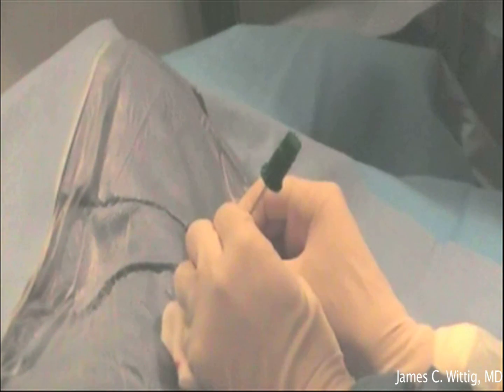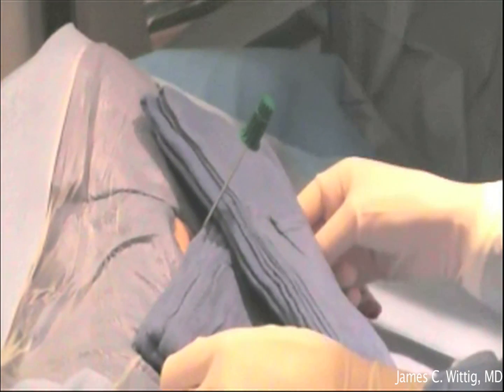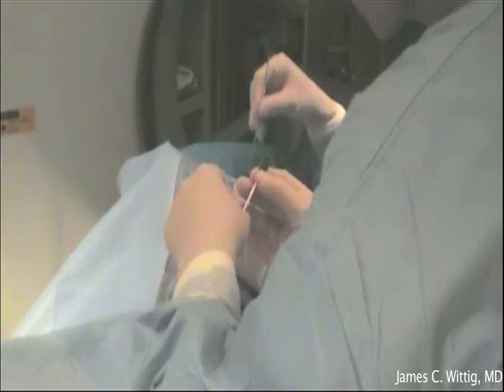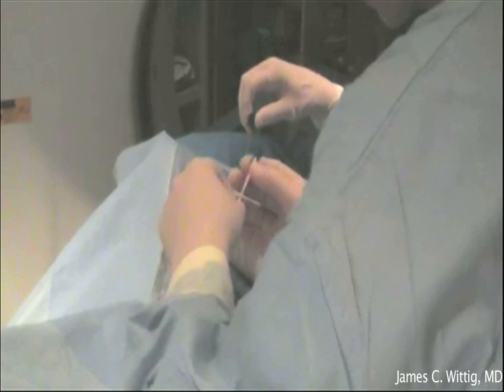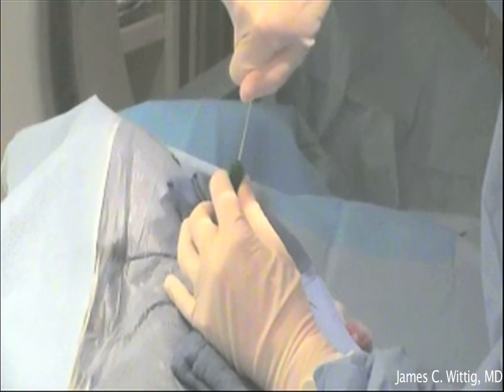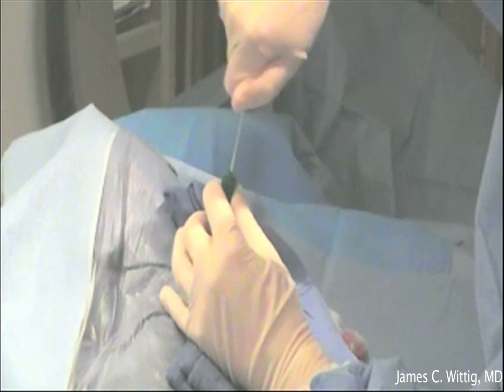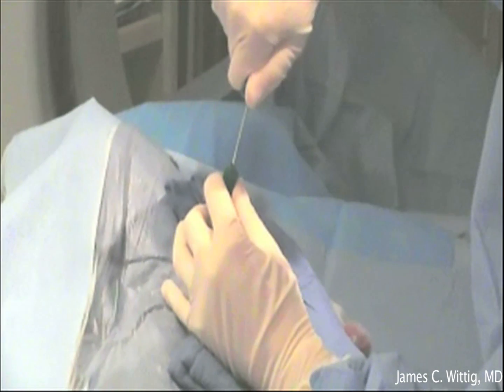A small puncture hole is made in the skin and a larger needle is placed down to the tumor. The patient is then placed through the CAT scanner to ensure the needle is in the proper position. Once confirmed, a small biopsy sample is obtained with a special serrated trocar, as demonstrated by the radiologist.